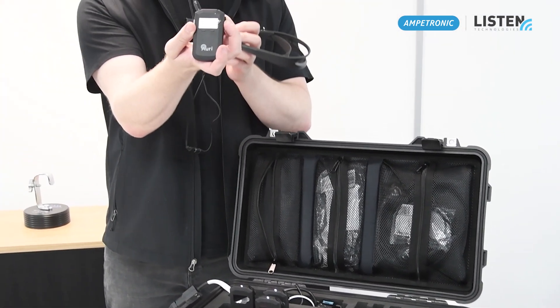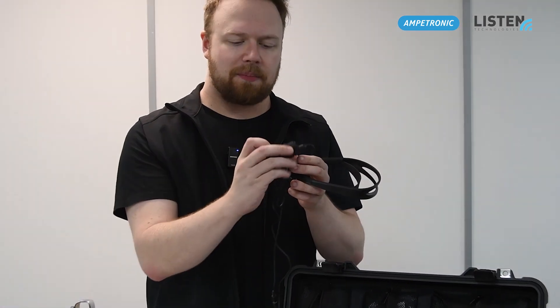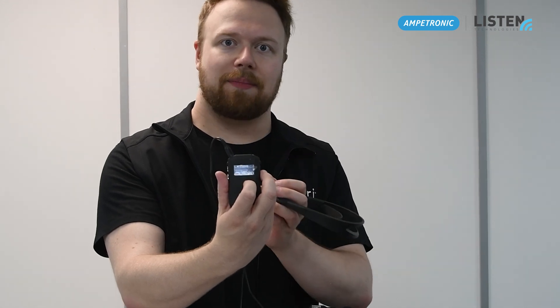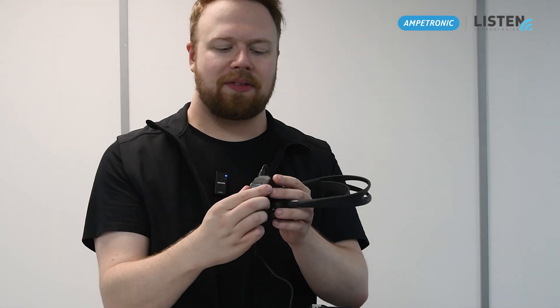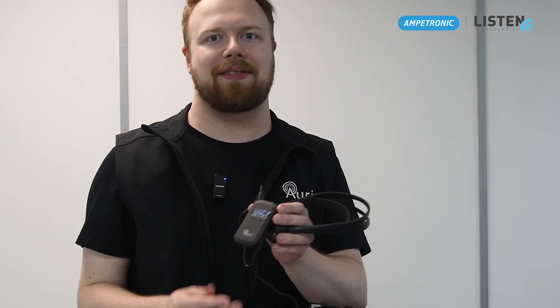To access this channel, go onto the receiver again, press the right button to wake it up from sleep, then press the scan button on the right. That will scan through all available channels and you'll be able to navigate to the media player channel using the silver buttons on the left. Once the channel has been selected, you can adjust the volume either up or down using the same silver buttons.